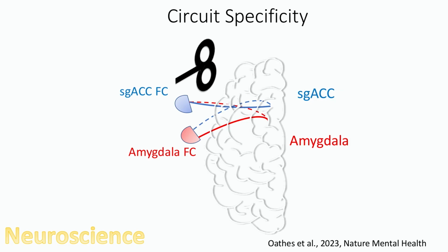There's no commercially available sham stimulator for the scanner. So in terms of practicality, one thing you can do is stimulate multiple active targets, and you get the whole brain readout, right? So you stimulate high subgenual connectivity, you stimulate high amygdala connectivity, you look at nearby evoked responses in the amygdala versus the subgenual cingulate, and you say, hey, is it important the degree to which you engaged the amygdala versus the subgenual cingulate? How does that relate to depression improvement? So that's what all these different lines suggest.